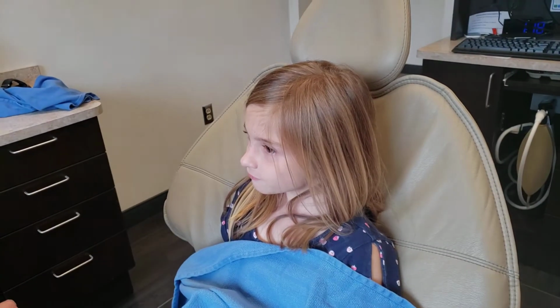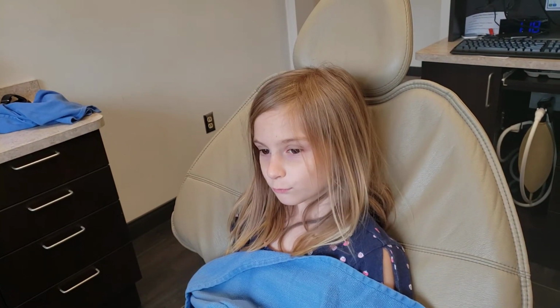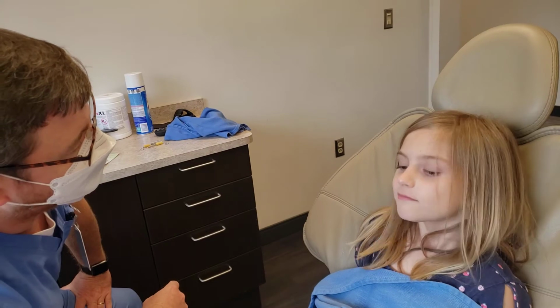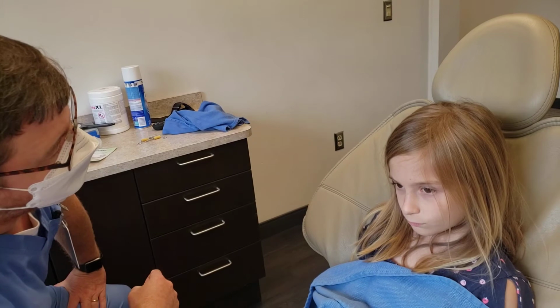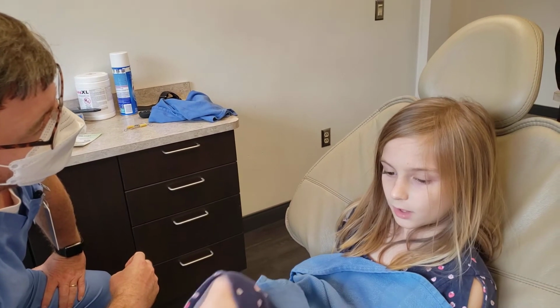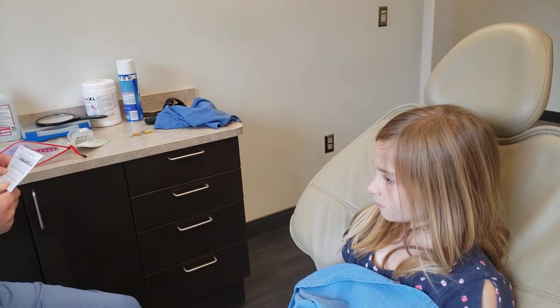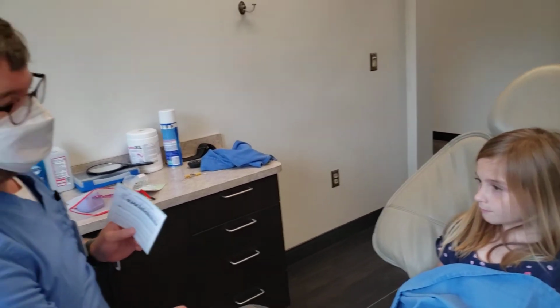All right, so what do you feel? Do you feel like anything's been moving, like teeth? Okay. How do you sleep with it in? A little harder, but easier. All right. So it was harder at first. Is it easier? Do you feel like you sleep better when you're wearing it or if you don't wear it? Yeah. It feels the same. So if you're wearing it on a regular basis and it's staying in, then for the most part, that means her body would have to do it well and it's opening up her airway.